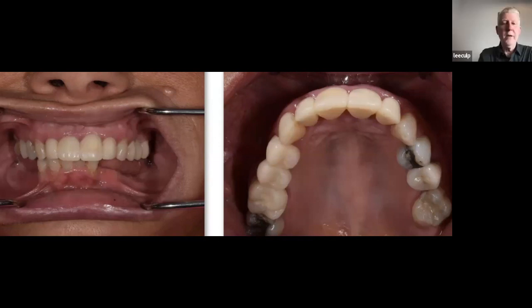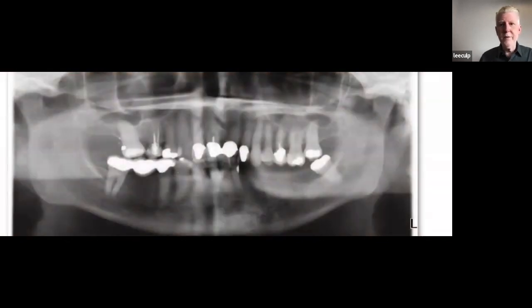Yeah, no, please. We divert, like I said, 20-25% of the cases away from that. But you take the class, this is what you do, you bone reduce, you do this, and I don't know, not on every case. Some cases definitely require it. This case requires it, but not to the extent. This is not a major bone reduction case. This is just kind of recontouring. But we know that from our digital plan. So I can tell the surgeon, this is what I'm seeing. What do you think?